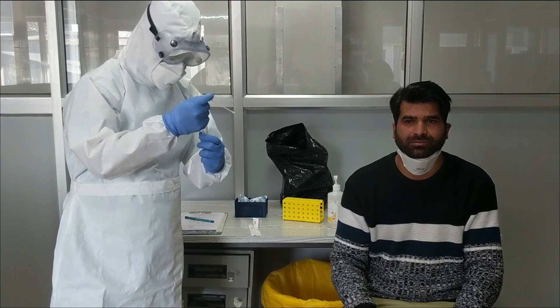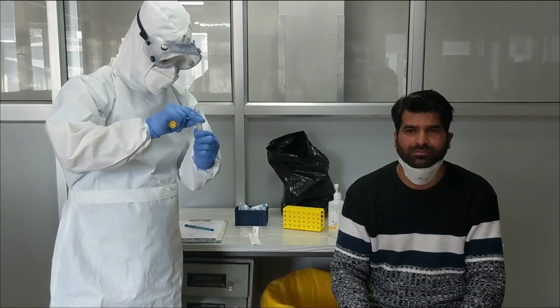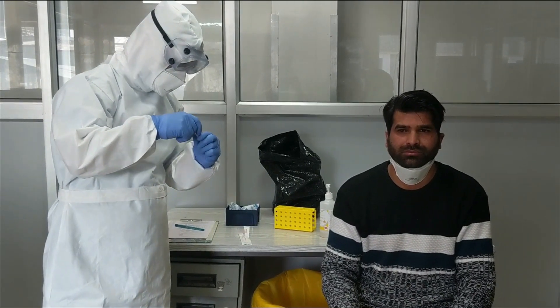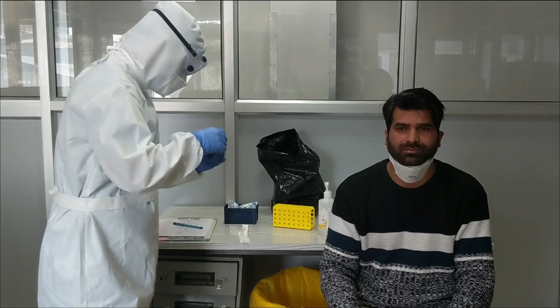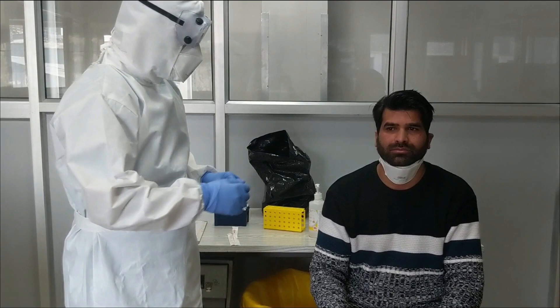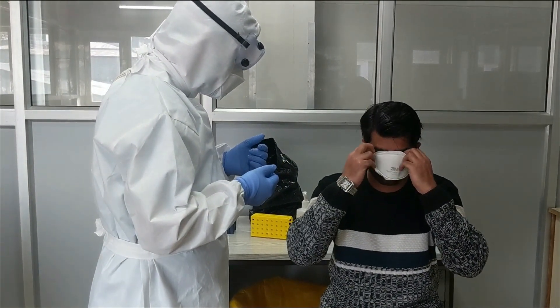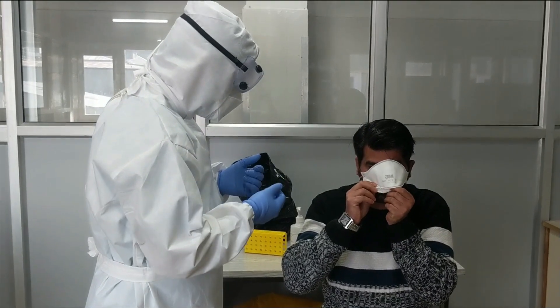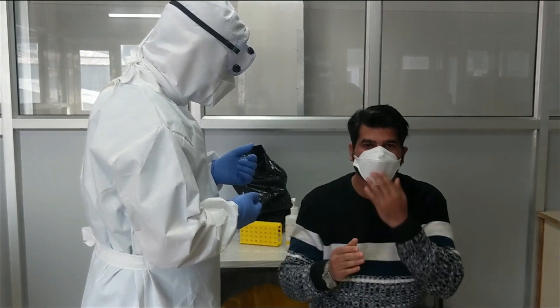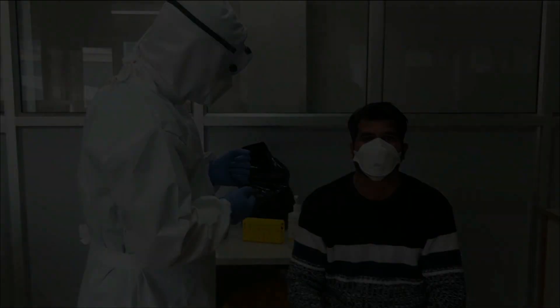Store the specimen at 2 to 8 degrees centigrade and ship to the appropriate reference lab on an ice pack. Label each specimen container with the patient ID number, specimen type, and date the sample was collected on the outer shipment container. If samples are unable to be shipped within 72 hours of collection, they should be stored at minus 80 degrees centigrade on dry ice.